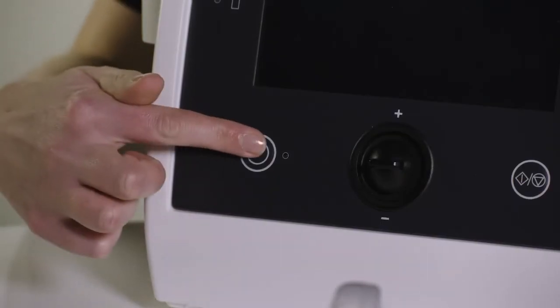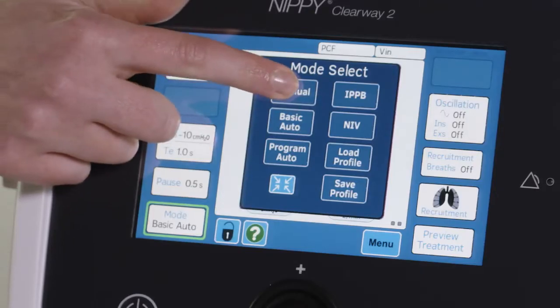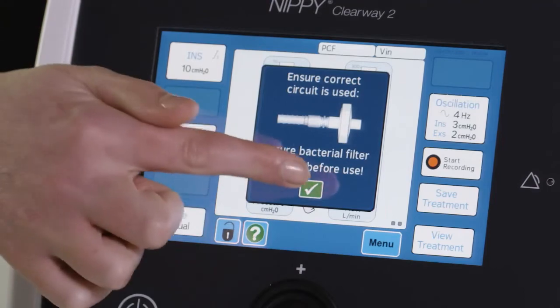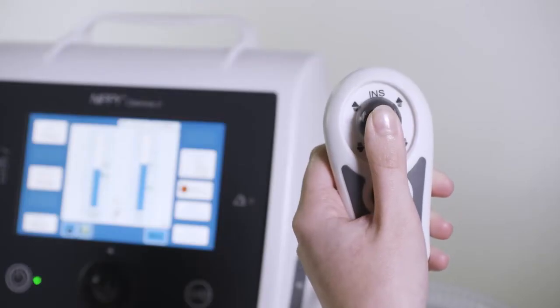The Clearway 2 has five modes of operation. Manual mode, where the pressure is delivered from the Clearway 2 using either the switch on the front of the device, the handheld manual controller, or foot pedal.